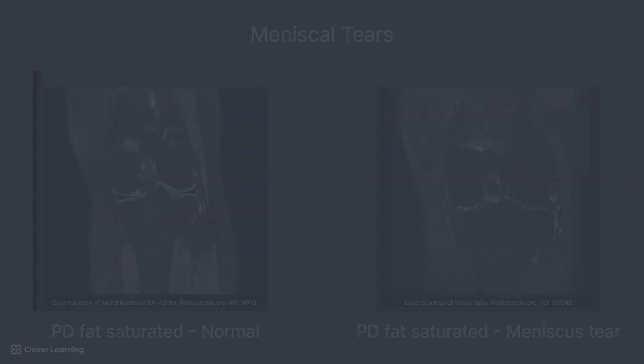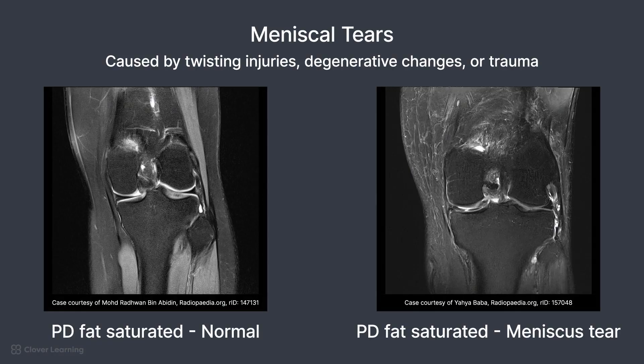Meniscal tears are often caused by twisting injuries during sports, degenerative changes in older adults, or trauma. They may also be further classified as bucket handle, flap, or radial tears. They appear as high signal defects within the meniscus on T2-weighted images, or irregular disruptions on proton density-weighted images.